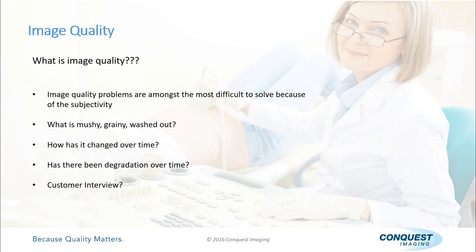So it makes it kind of hard to solve the problem if you don't understand what the issue is. One of the things we can do is check to see, has this image quality changed over time? The way we can do that is when you bring a new ultrasound system into your hospital, the very first day it comes in to be examined and checked and electrically safetied, all the things that we need to do to put a piece of equipment into service, you should do an image quality check with it and capture photos, capture printouts.